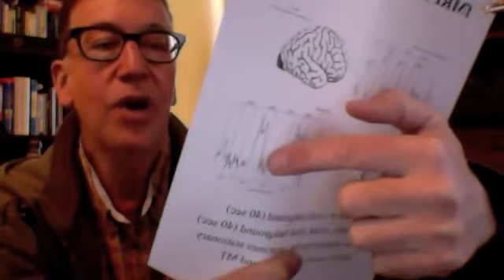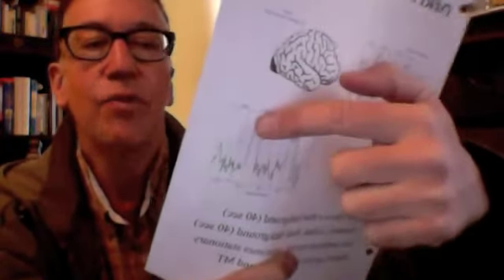So you don't see any increase in blood flow into the area to support any increased activity. Then you go to the blank background, and you go to moving dots again, and that's what really gets area MT going. So this is a technique that can show you, in a healthy human subject, their brain in functional action in response to, in this case, different types of visual stimuli.